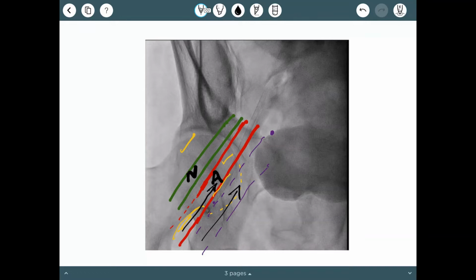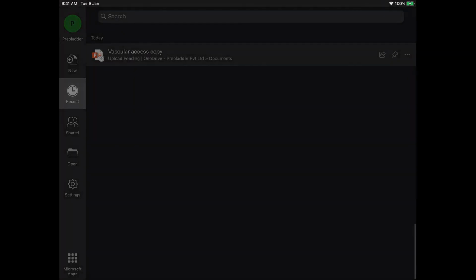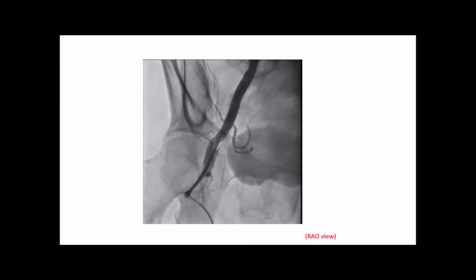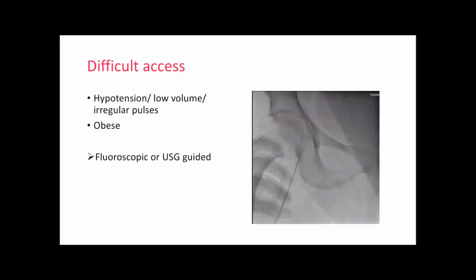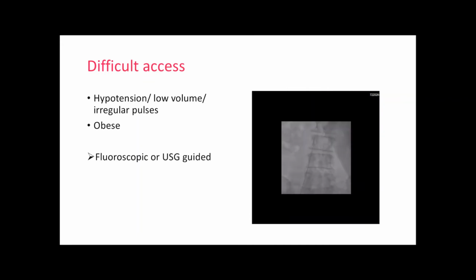So this fluoroscopic guidance can help you when you don't have an ultrasound or when there is an emergency, and it can help you in those situations.